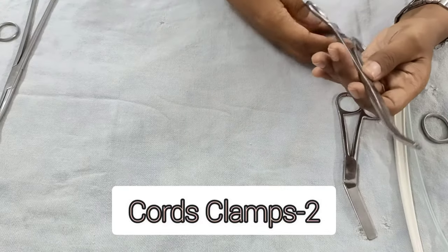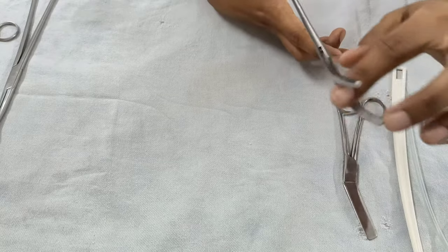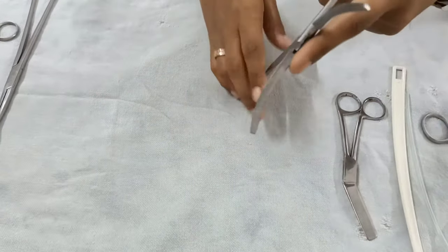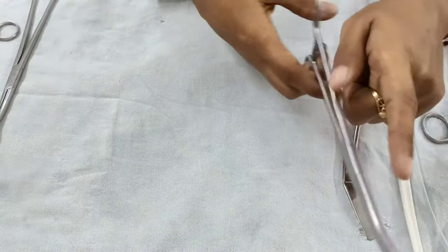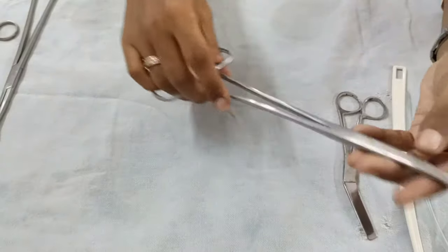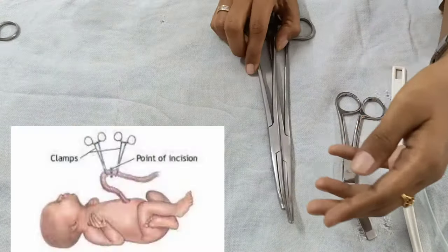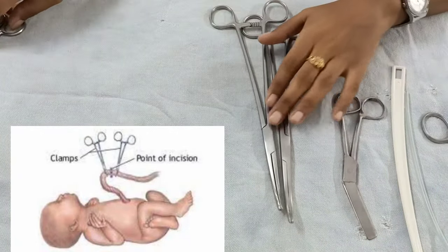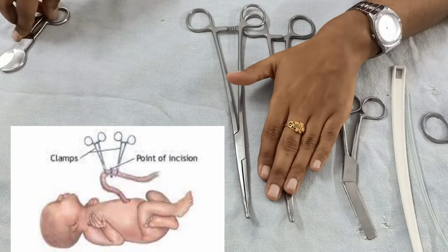These are the cord clamps — instruments that hold the cord at its distal portion. They have transverse serrations and a lock at the end where you hold them. You require two cord clamps: one for the maternal side and one for the baby's side.